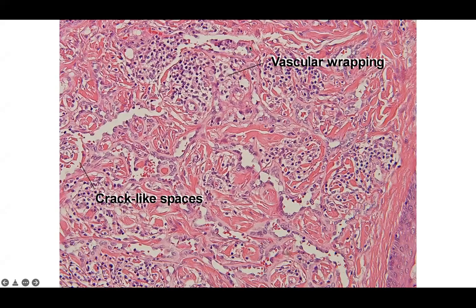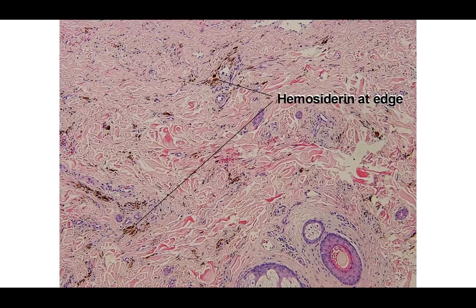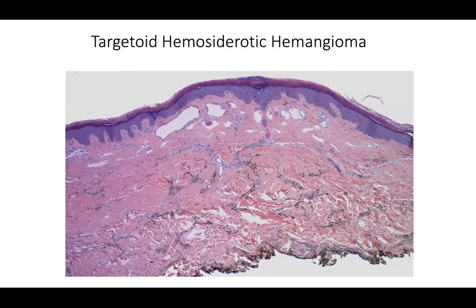You can observe a vascular wrapping phenomenon with crack-like spaces in hobnail hemangioma. These crack-like spaces may make you think of angiosarcoma, but the endothelial cells are not as atypical and there is no endothelial stacking with the high density seen in angiosarcoma. Hemosiderin is at the edge of the lesion. Putting together the clinical and histopathology, you'll make the diagnosis by looking at the distribution of dilated thin-walled vessels centrally and the peripherally located hemosiderin.